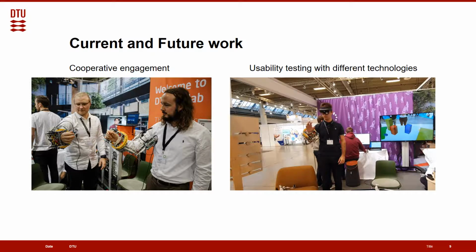Recently, our researchers have connected 2 exoskeletons in a primary and secondary control arrangement, where the primary serves as lead and sends any motor movements to the secondary exoskeleton to replicate, as seen in the image on the left. This has implications for remote rehabilitation as guidance or controlling the exercise, but also as a venue for empathy. If a patient wears the primary, and the therapist or other stakeholders wear the secondary, they can experience from a first-person perspective what the patient has done during rehabilitation.